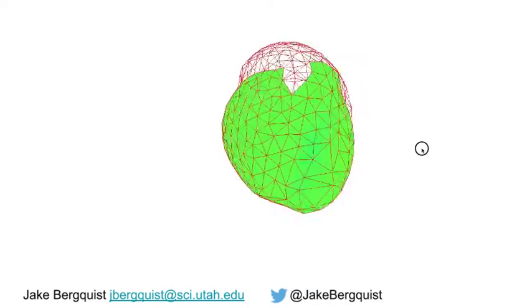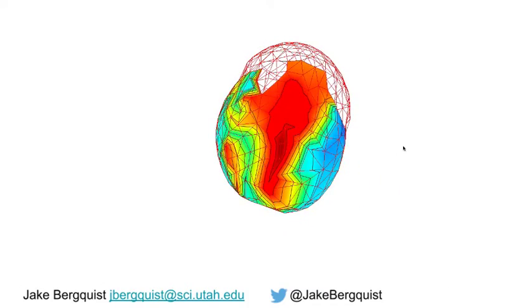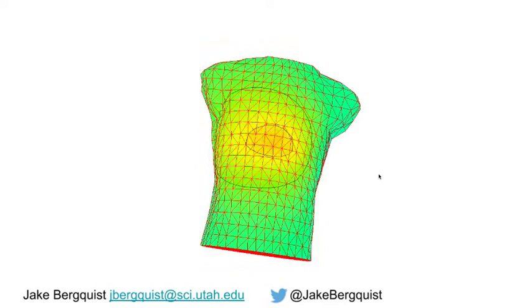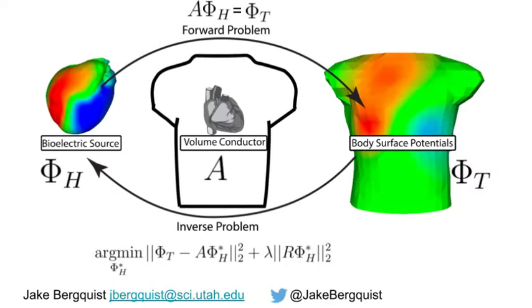ECGI leverages the physical principles that dictate how cardiac electrical activity can be seen from the torso surface, and then uses torso surface recordings to reconstruct this electrical activity at the heart.